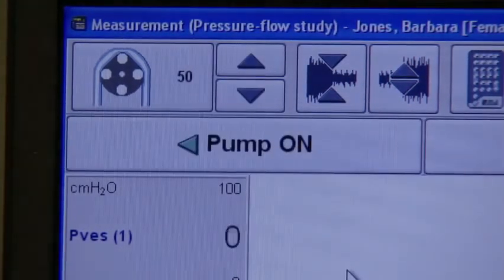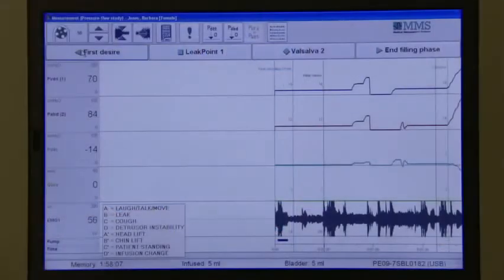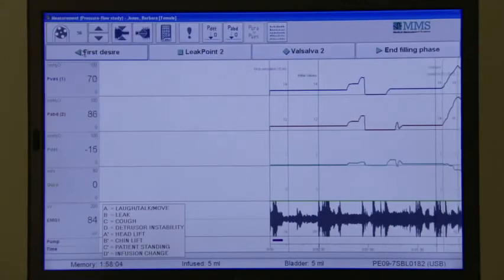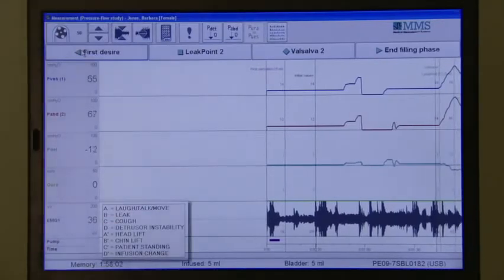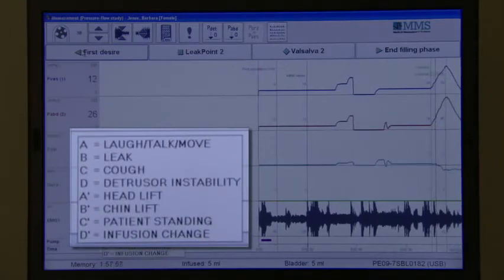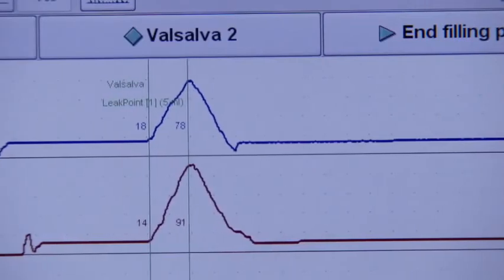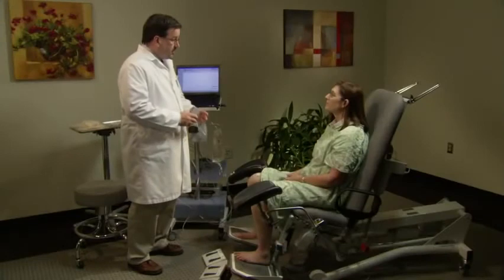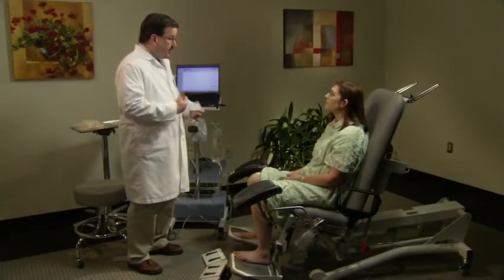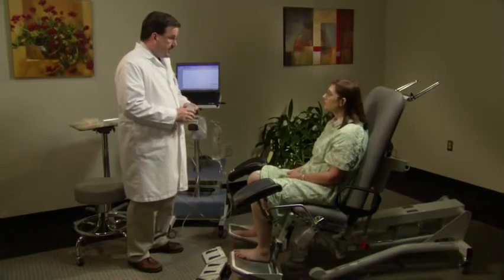During the filling phase of the pressure flow study, the wireless remote enables the clinician to complete the entire study without going to the computer. Not only can pump speed and EMG be controlled by the remote, but up to eight customizable event markers, as well as Valsalva leak point pressure, can be recorded using the remote, giving the user complete control. The nurse turns on the pump and begins filling the bladder, asking the patient to report her first sensation.